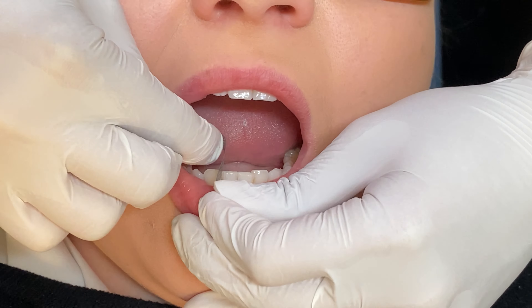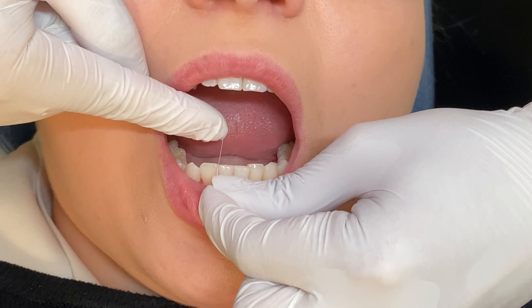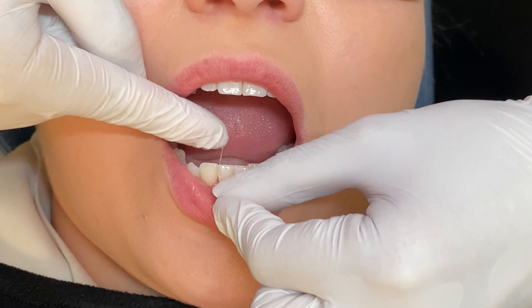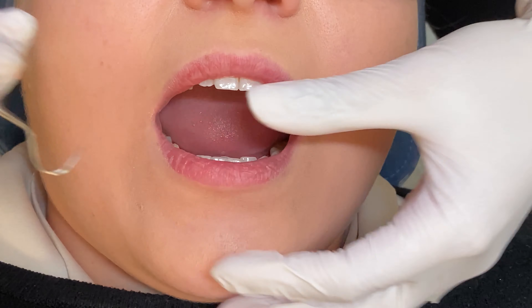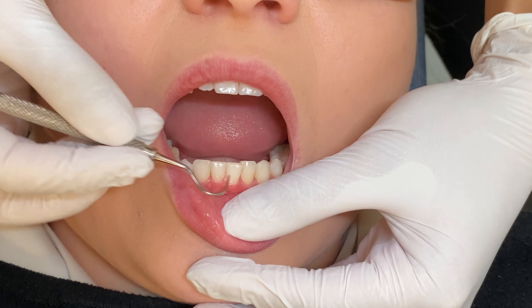Check each contact with floss again. Your floss should slide through the contact much easier, with no ledges, especially beneath the gum line. A ledge will occur when there is space in between the teeth; however, there is still a contact at a deeper level, generally beneath the gum line. You will need to go deeper with the strip to remove this.